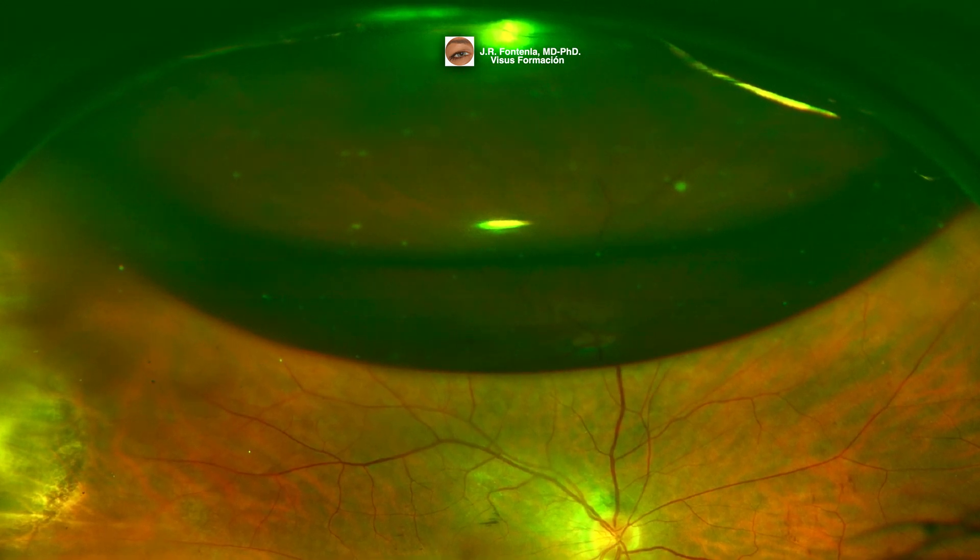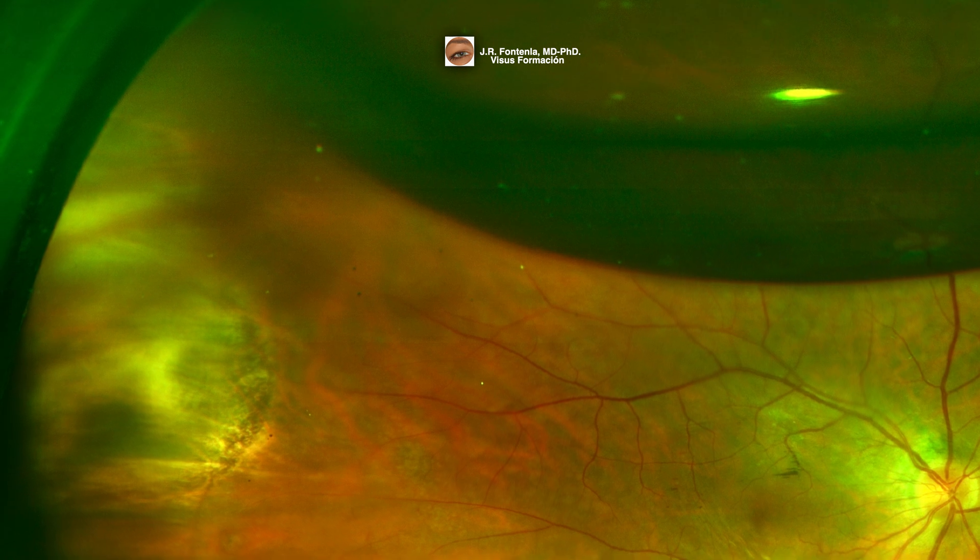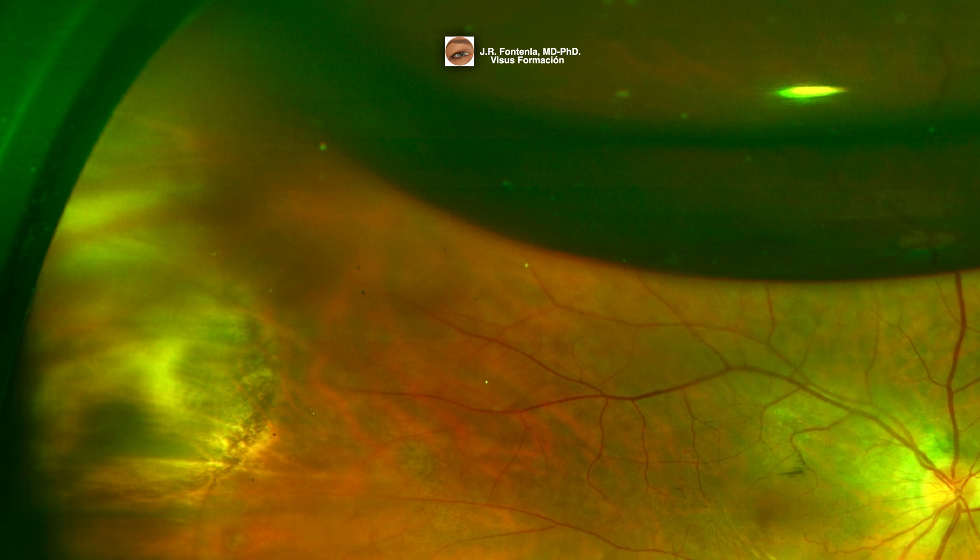In this picture we can see the intraocular gas bubble and retinal scars from cryopexy.